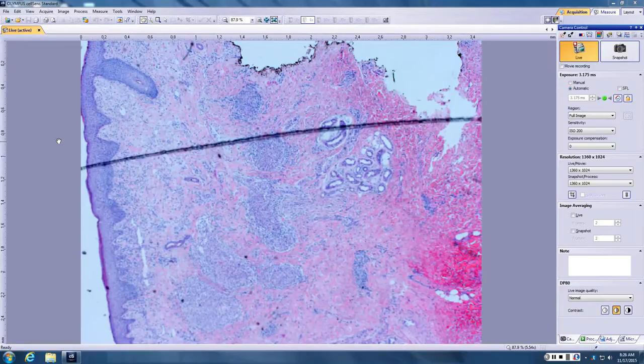I mean, the big one obviously is sarcoidosis, but you also have to think about borreliosis. So sarcoid, zirconium, beryllium, what else is in there? If I got a puffy lower lip, like Melkersson-Rosenthal. Melkersson-Rosenthal, cheilitis granulomatosa. If I've got Crohn's, absolutely. So if this were a woman or young girl with terminal ileitis and massive swelling of the labia, you would think cutaneous Crohn's.